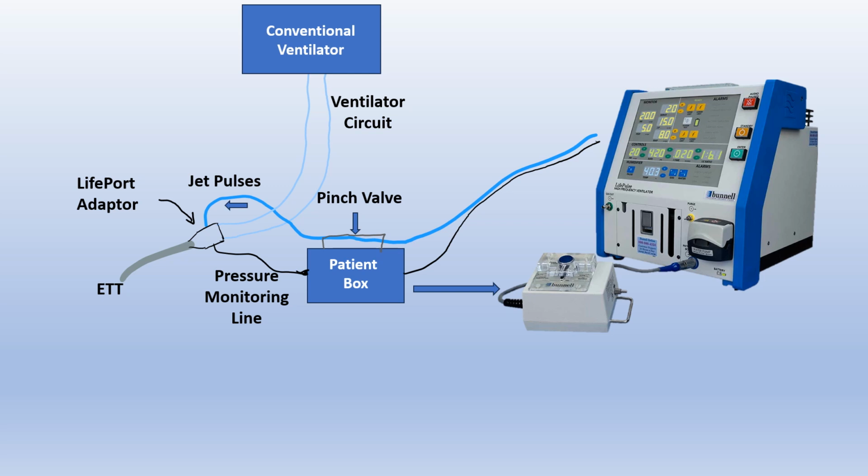The jet port and pressure monitoring tube are connected to the patient box, which sends information back to the jet ventilator.